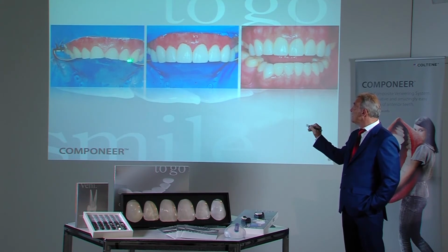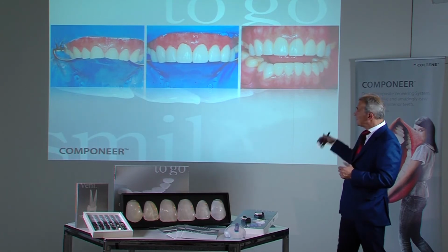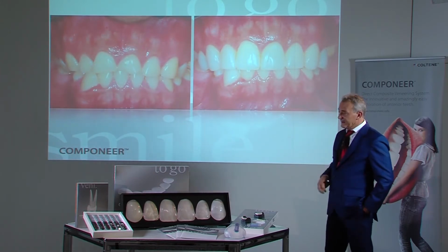Here too, we have a tendency towards crossbite. The buccal areas are slightly reduced. As we want to shift forward slightly, we've moved the mandible back at the same time to correct the situation in this region.